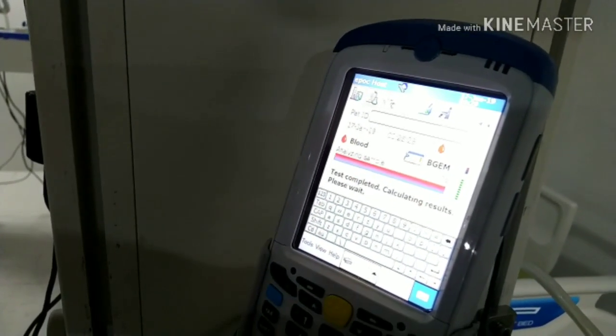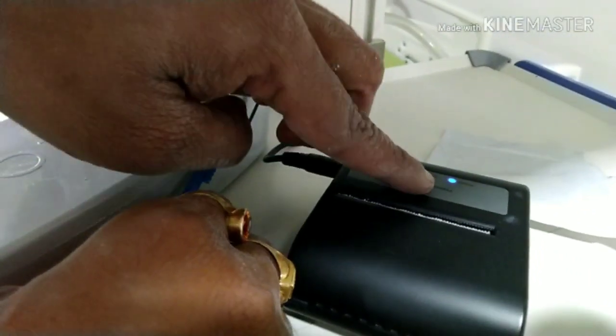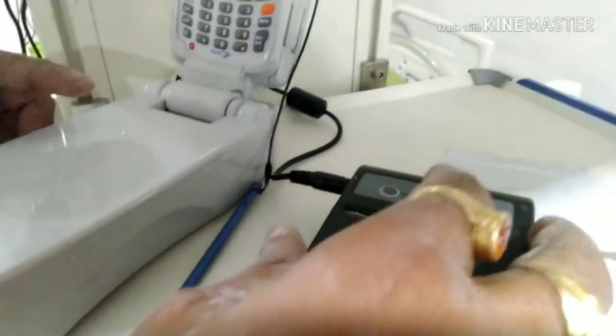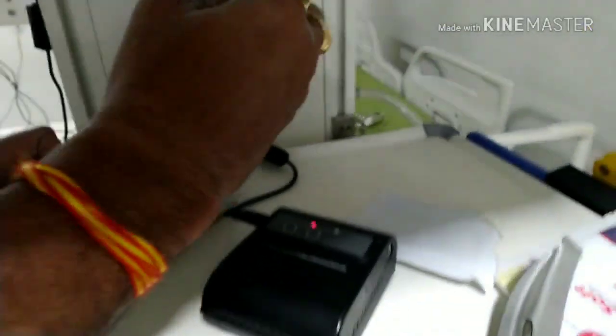Test completed! Calculating the result of the ABGs. Now let's see — this is the smallest printer I have ever seen. Select the printer operation and please enter.